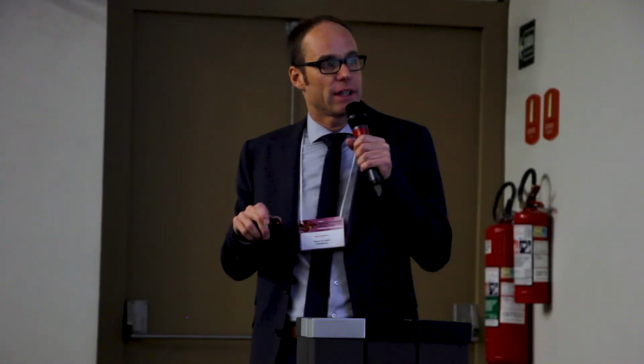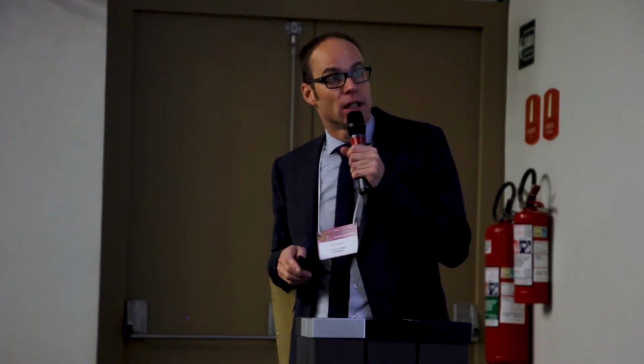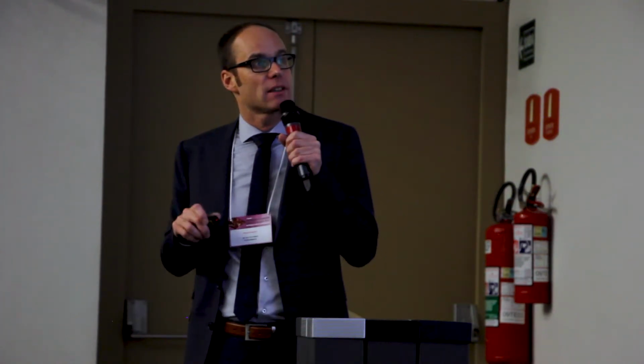So the throughput is roughly 80 seconds per well. And we can handle different objectives. For Hep cells, we use the 20-fold magnification. For tissue, we mainly use the 10-fold. For Crithidia, for example, we use the 40-fold. And you can also use this microscope completely as a manual microscope, meaning you can also read visually without using the software.